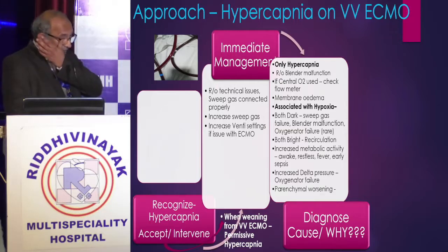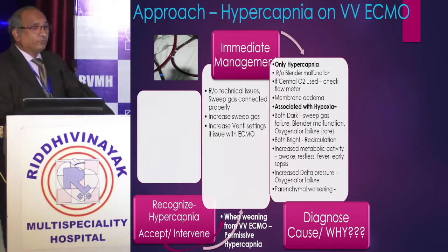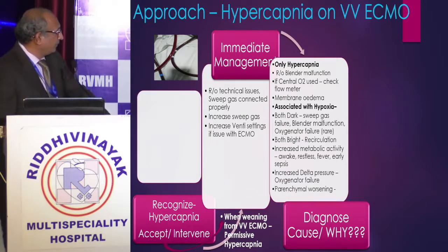Your staff might not have done it overnight, so the CO2 is high in the morning. You have to increase the sweep gas to 15 liters, wait for 15-20 seconds, and again get back to normal. Okay, that is what you do.